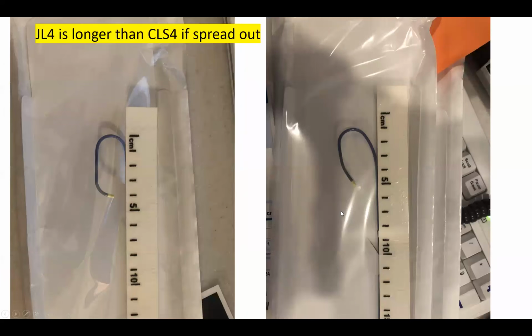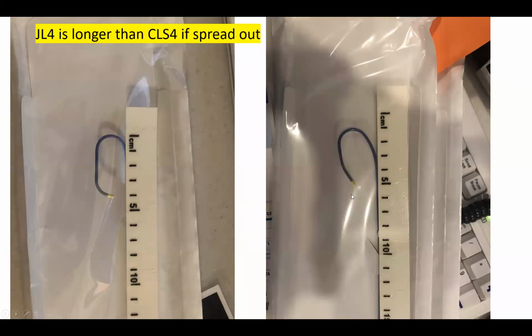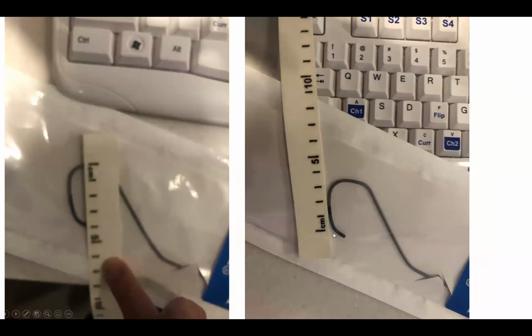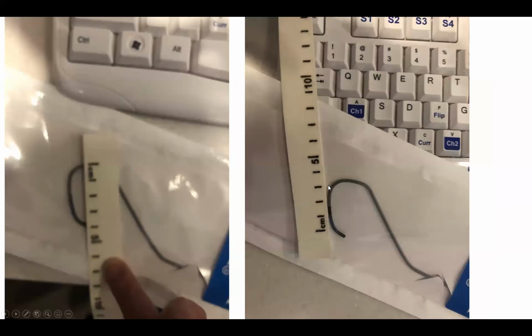This is the Ikari left shape, by the way. It's a little more bent at the tip, unlike the CLS and EBU, which have minimal to no bend. EBU has no bend at all. This one has a little bend, nowhere near as sharp as Judkins though. And note the platform on the Ikari is larger than the platform on the CLS, that platform that sits on the aortic wall or on the aortic valve. That's another reason that makes the Ikari a more stable catheter in right radial engagement. It has a larger platform. Unfortunately, the lighter weight of the catheter takes away some of its robustness and support, but it's a very friendly catheter.